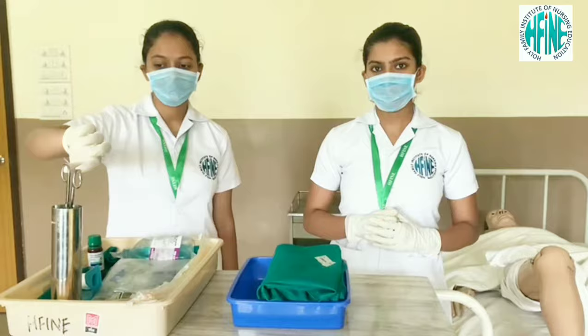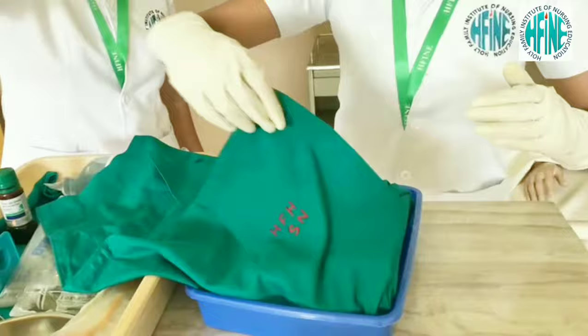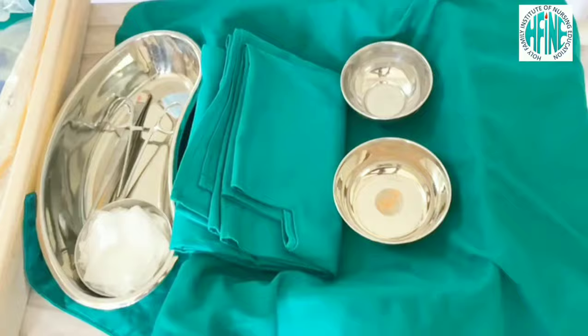With the help of the assistant, open the outside layer of the sterile tray. Open the inside layer of the sterile tray. Pour the solution into the bowl.